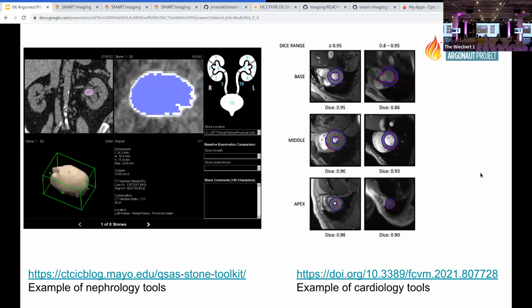And just to be a little bit more technical on the clinician-facing side, there's a lot of work happening right now at the research level to understand how to make better automated predictions based on imaging data. But this work is not widely or evenly distributed across the field. So there might be some academic centers that have gone really far in developing their own algorithms for calculating kidney volume, and others who have been focused on automated measures of heart MRIs. And by making imaging data available through the same pipelines as clinical data, we allow these connections to flow. We can start running these calculations, even if the group that built them is not deeply connected with the site where the images were taken.